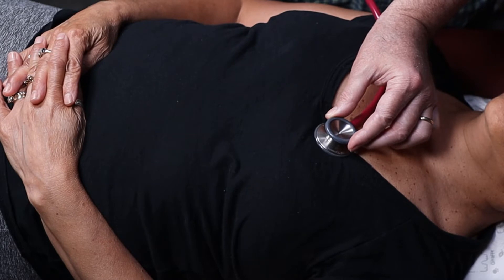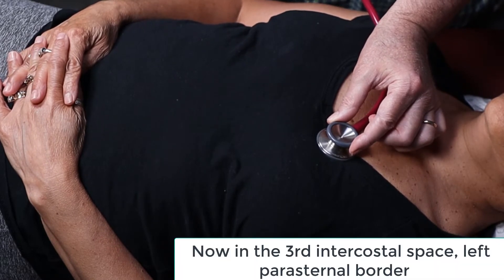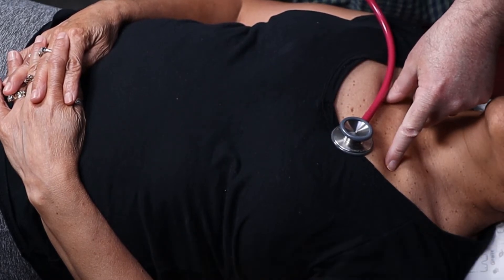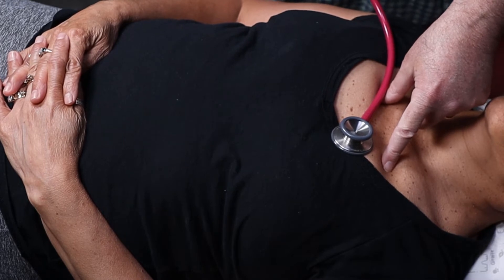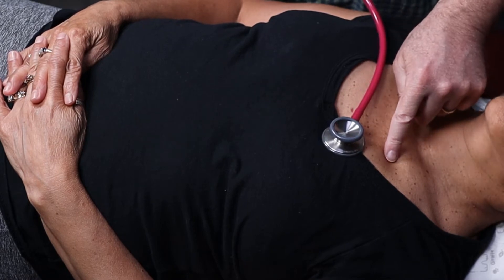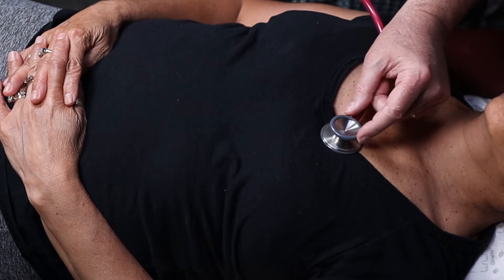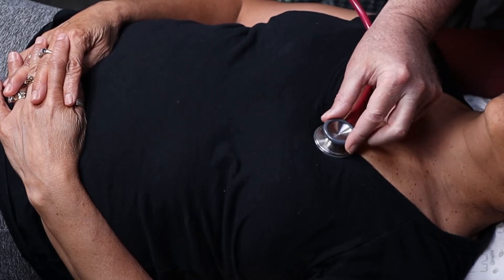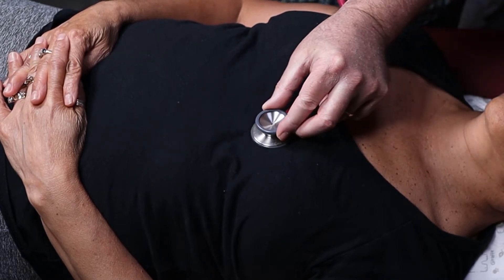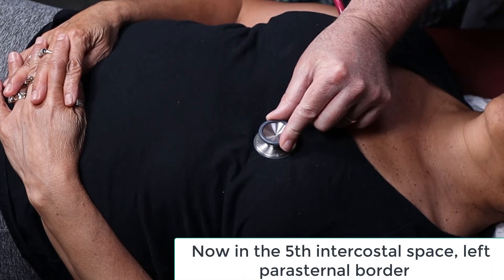I'm going to go down one intercostal space — now I'm at Erb's point. It's a great observation deck because you can hear the aortic and pulmonic valve at equal strength. Why don't I hear the pulmonic valve at more power even though it's closer? Because the aortic valve slams much harder than the pulmonic valve. So, Erb's point. Now I'm going to do a big jump all the way down to the tricuspid — all pigs eat two — so we're on two, the tricuspid area.